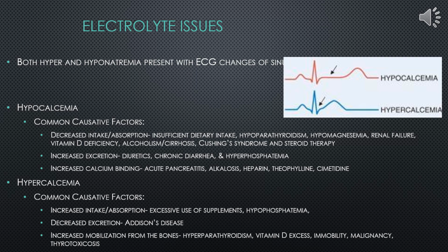EKG changes as opposed to hypocalcemia. Hypercalcemia is going to be shortened QT interval. The arrhythmias and AV blocks can be also pretty common with hypercalcemia.